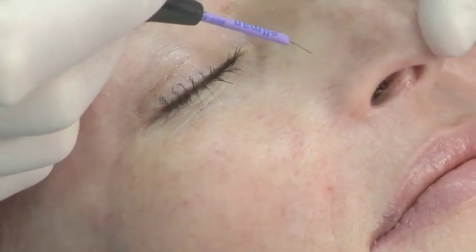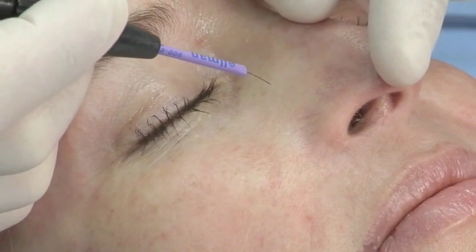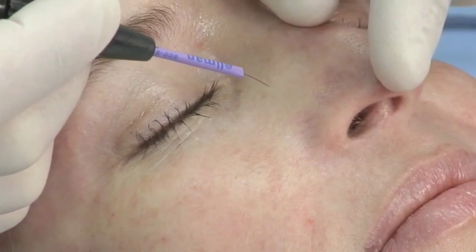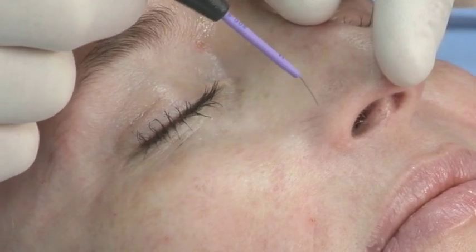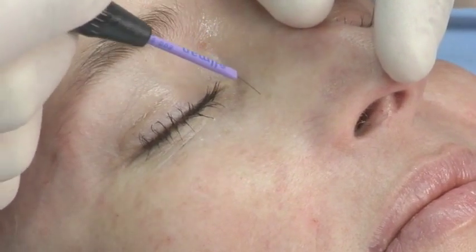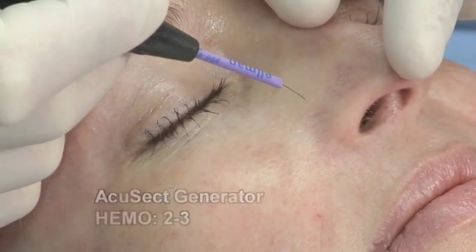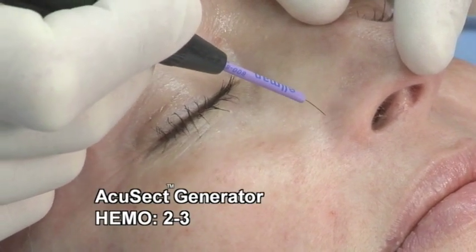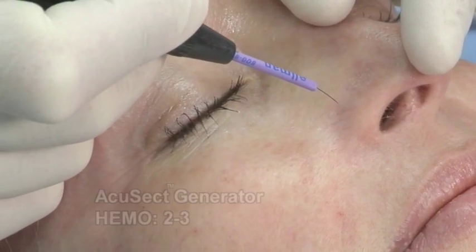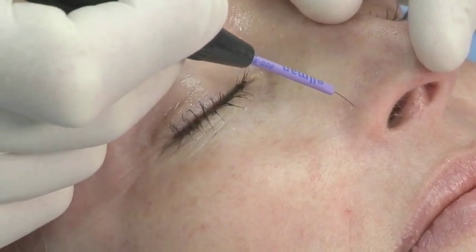Patients can come in and have very minimal redness afterwards — they can put some makeup on about an hour later and go about their business. If you look right here, hopefully you can see these demonstrated — these little, small, very fine telangiectasias. In terms of treatment, what I do is barely puncture the skin because that's where these live, and you kind of trace them out. It's a very sensitive area.